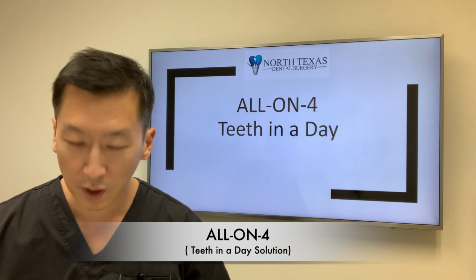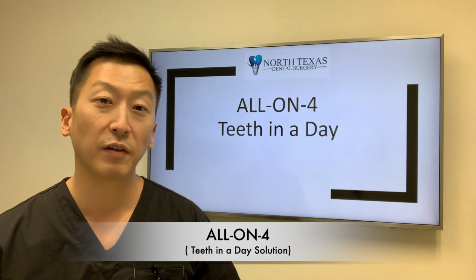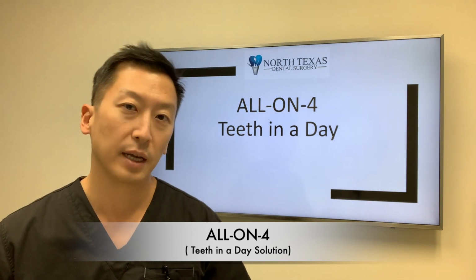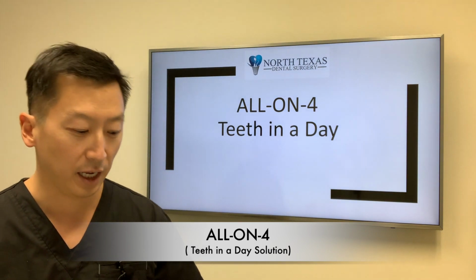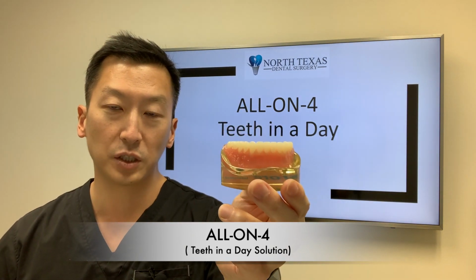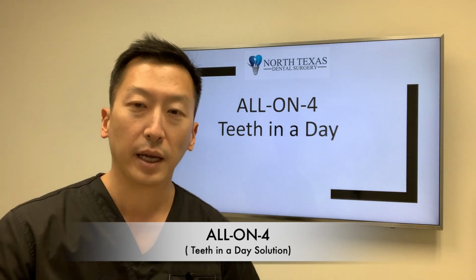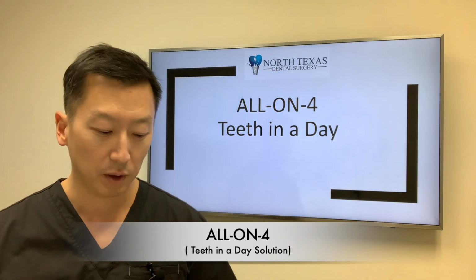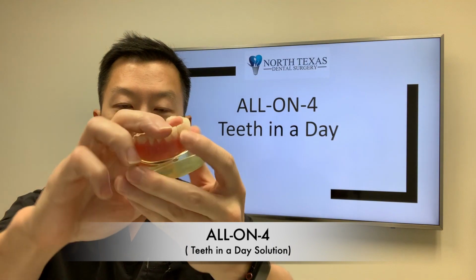So when dental implants were introduced many decades ago, the benefits of having dental implants crossed over to implant-supported dentures. Now there are really two classes of implant-supported dentures out there. The first one is the snap-on denture, and the other option is the all-on-4 solution. So what really is the main difference between these two? Well, the snap-on denture is exactly that. It is a snap-on denture.